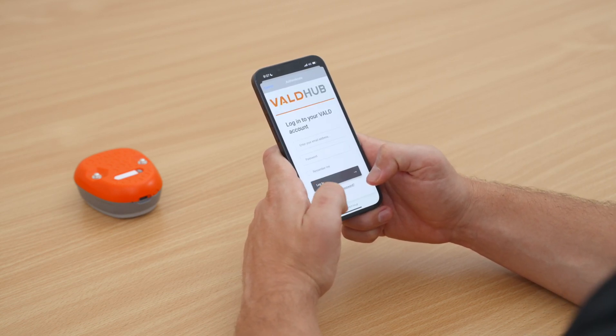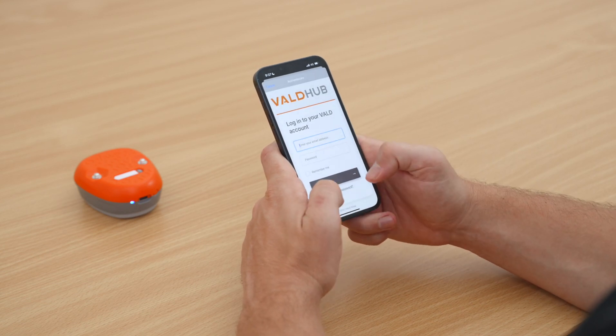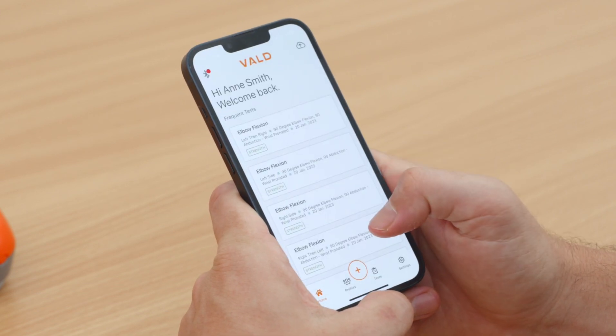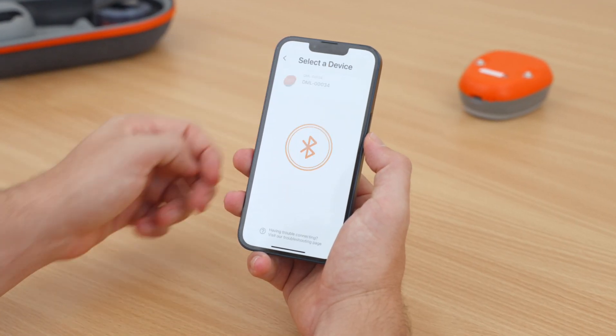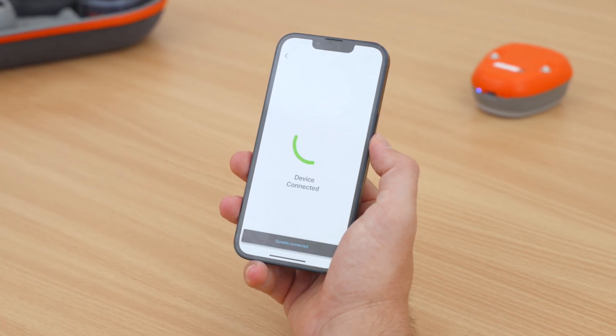From the welcome screen, you can follow the prompts to create a profile and conduct a test. The app collects your results and data when connected to a Dynamo device. To pair your devices, ensure that you have Bluetooth enabled on your mobile phone, then tap the Bluetooth button in the top left-hand corner of the Dynamo app. On the pairing screen, select Dynamo Lite to pair your device.